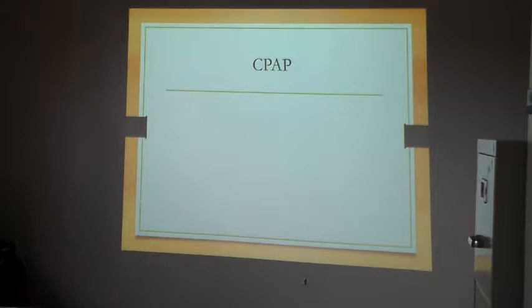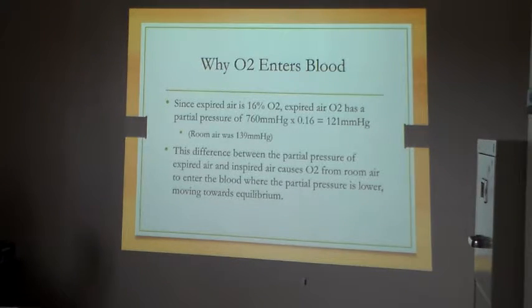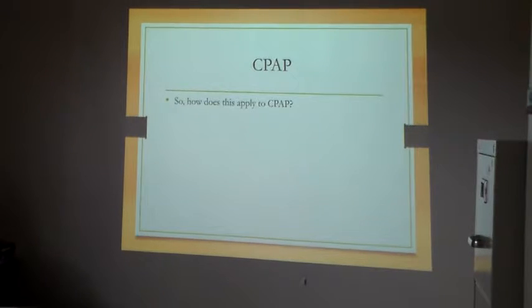What that means for us is, as we're ventilating a patient, it actually only creates a small percentage of change, but creates a huge difference. CPAP, this applies to CPAP because it changes the pressure gradient. Instead of having that 121 or 139, it actually has a slightly higher pressure gradient. So it forces against something that's fighting against it.